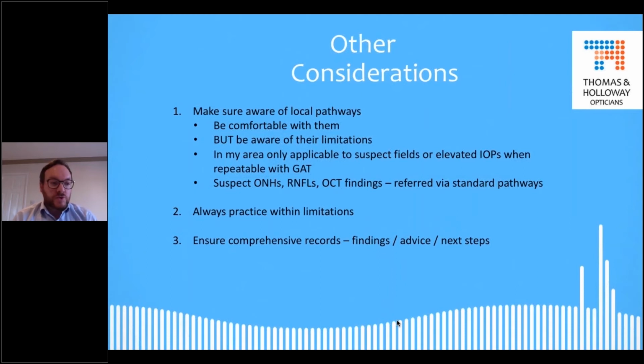And the other thing is make sure that you've got comprehensive records. Record even for your OCTs and your visual fields and things like that. Make sure that you record your findings, the advice that you've given the patient, and the next steps. And the other thing that I tend to do is make sure that I've recorded that the patient is happy with the decision that we've made together, because I think that's quite important as well.